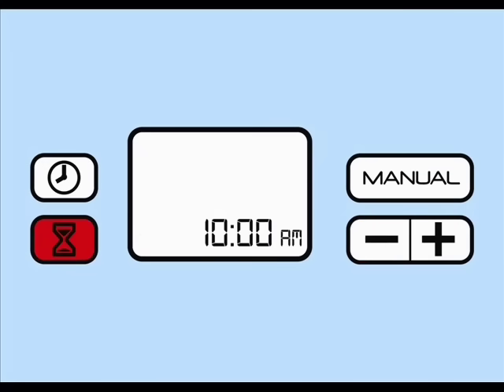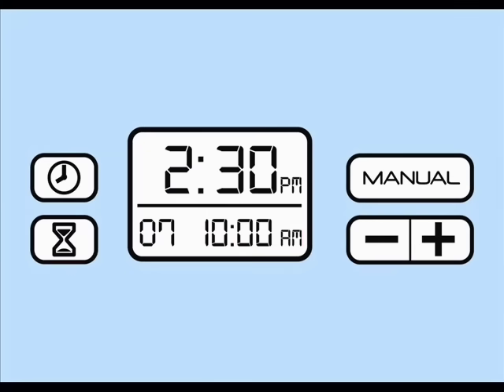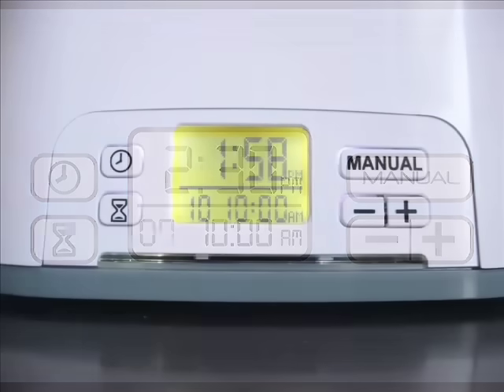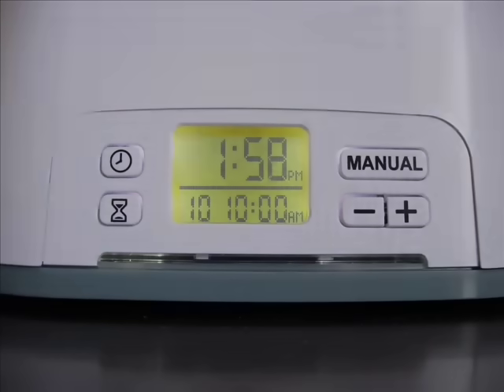Now, push the hourglass button once more to set the time of day you'd like your SoClean to begin its cycle. Use the plus or minus button to reach the desired time. Finally, press the hourglass button one last time to store your settings and return to the home screen. You're now completely set up and ready to run.